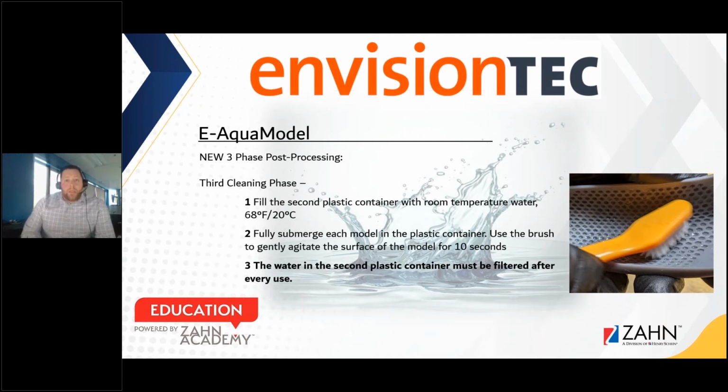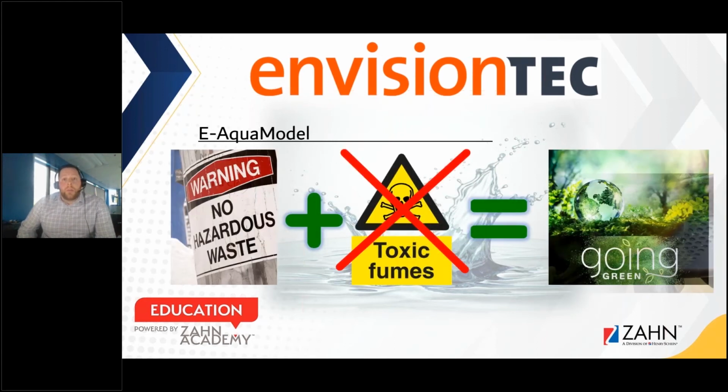So there's a number of advantages of doing it this way, and the advantages of the E-AquaModel coming into the market. I touched on this a little bit earlier, but this was about not having that hazardous material, not having the toxic fumes, and bringing an element of going green into the office. We no longer have to worry about the disposal of the IPA alcohol. We no longer have to worry about the caustic materials of the resin being spilled all over the place in conjunction with the IPA model.